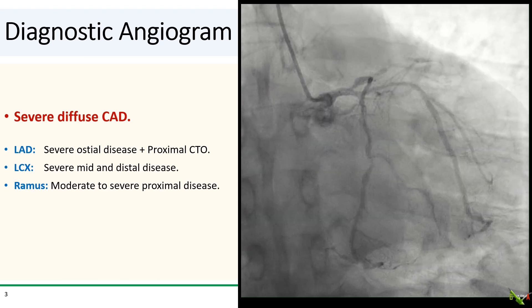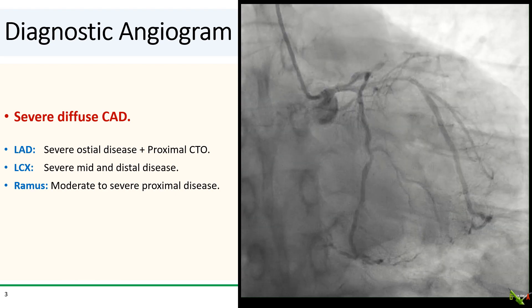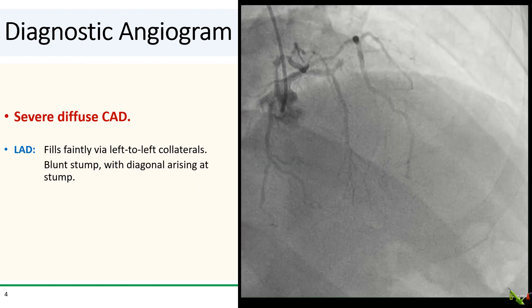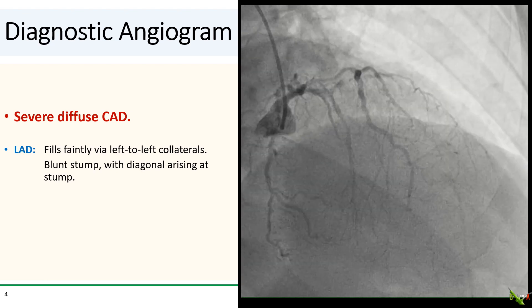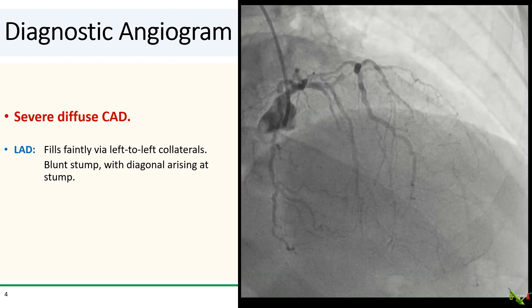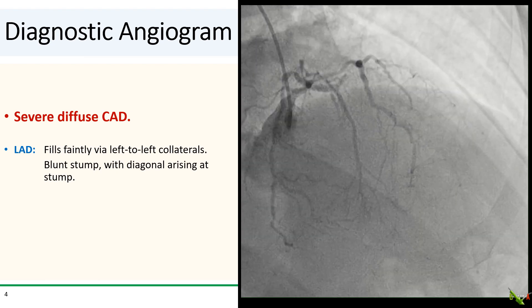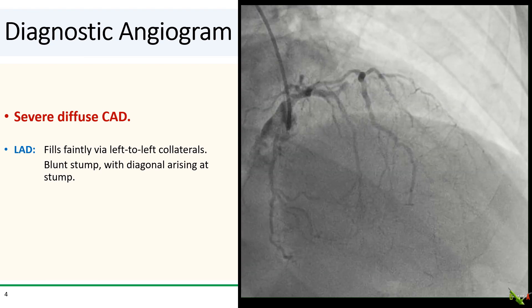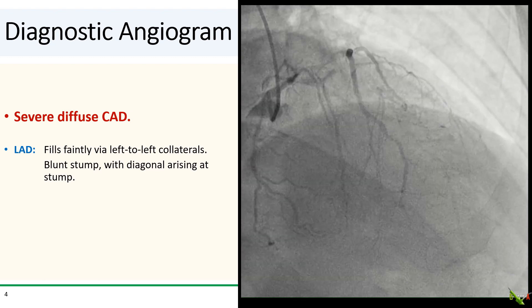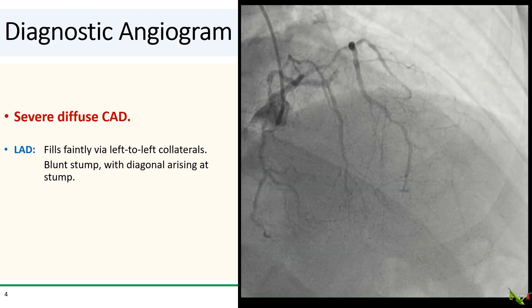The LAD has severe ostial disease and a CTO approximately. The circumflex has severe mid and distal disease, and the ramus is a fairly large vessel with moderate to severe proximal disease. The CTO looks to be over 20 millimeters long, and it has a blunt stump with a diagonal branch arising at the stump. It also looks like there's going to be a 90-degree turn at the occlusion to get to the remainder of the LAD. These factors could all increase the difficulty of successfully crossing the CTO.